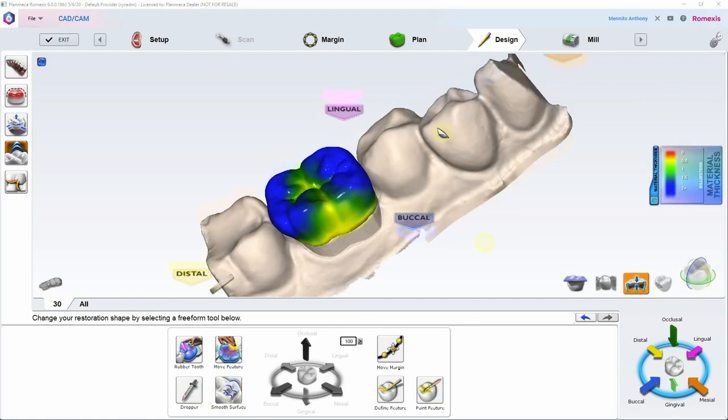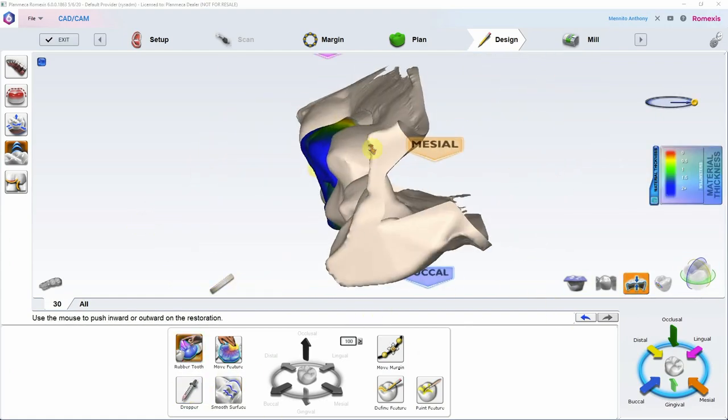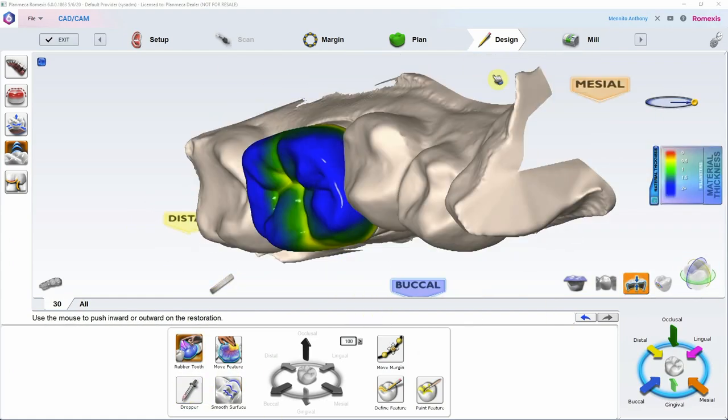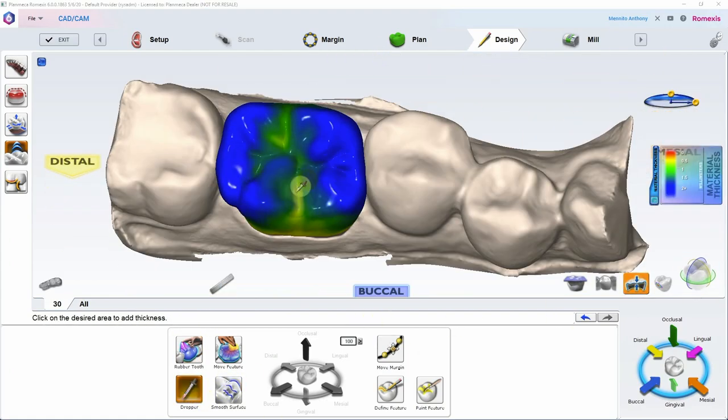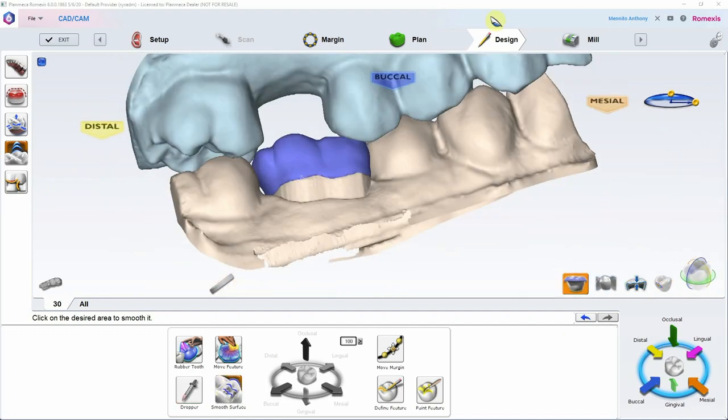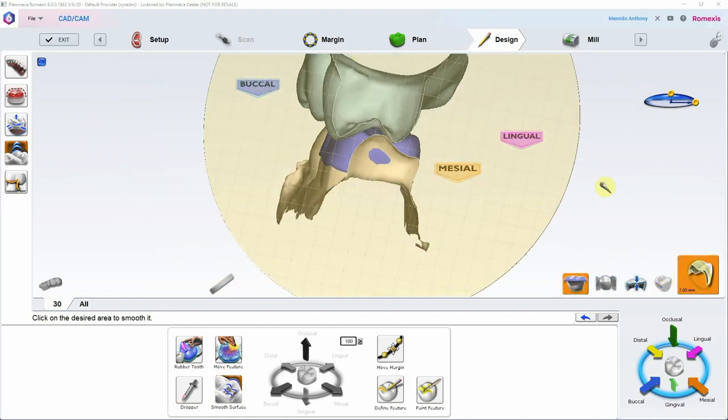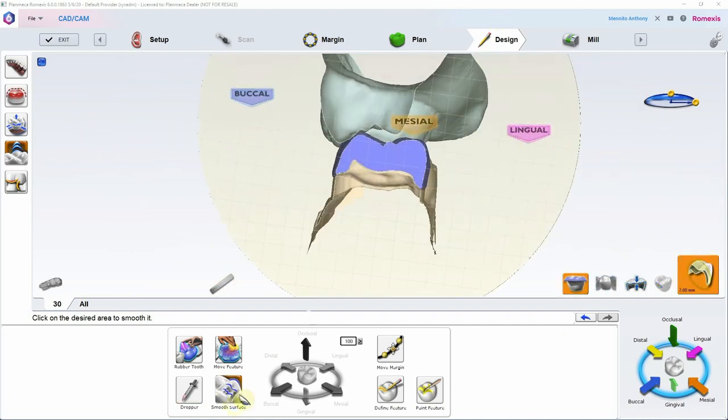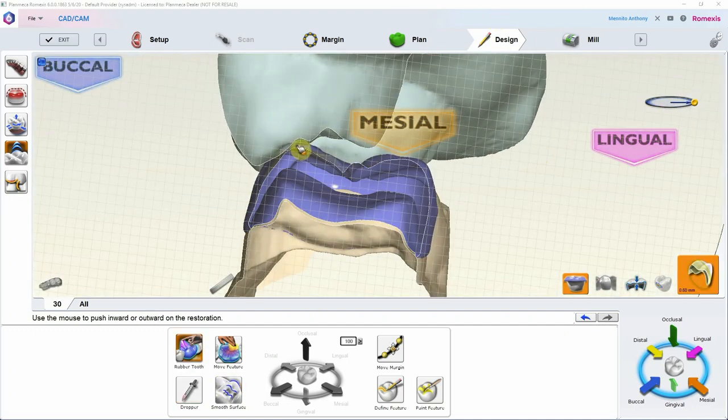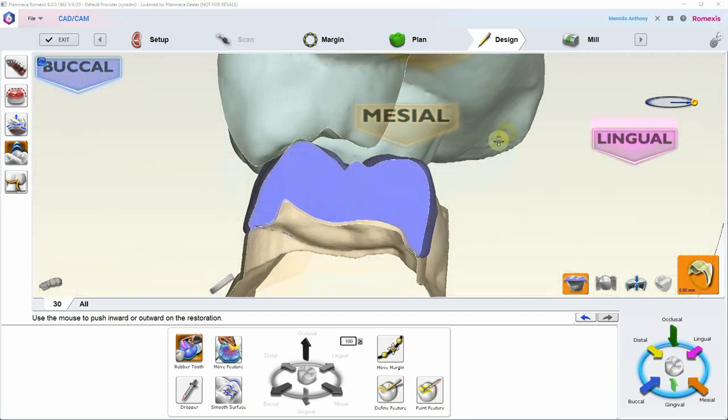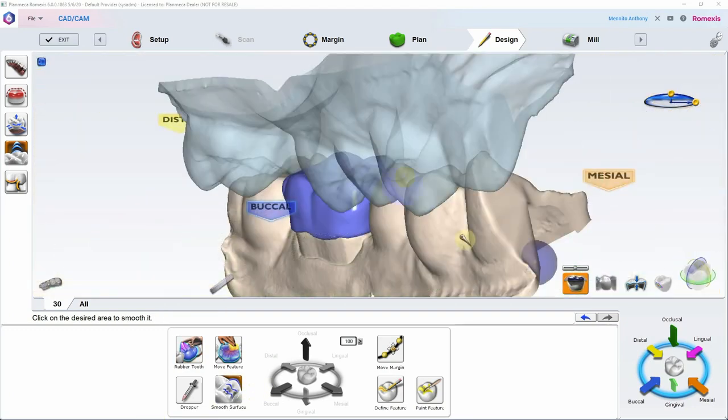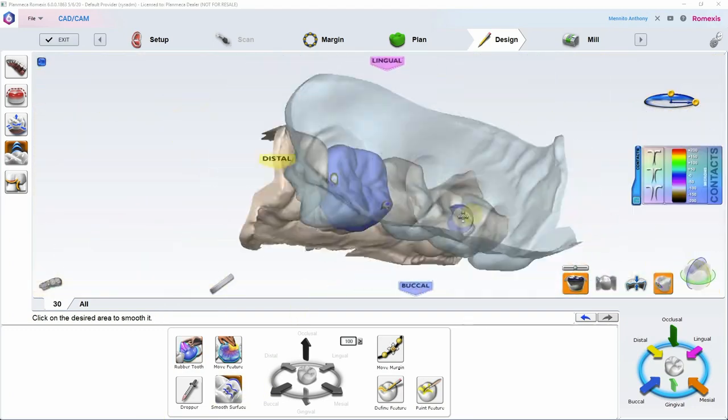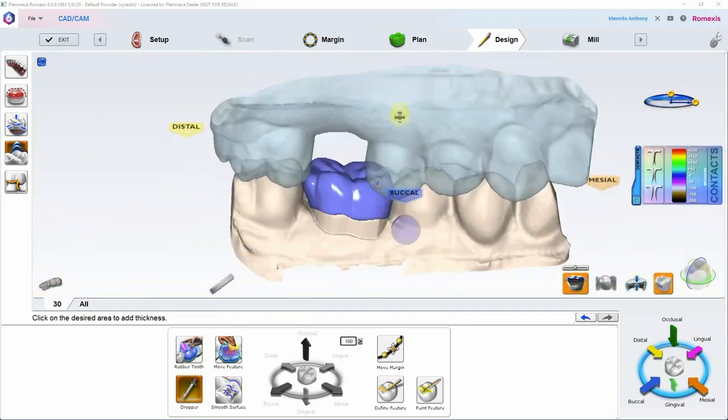The pre-op tool is very, very helpful for that. But since we are just able to import two STLs, the prep and the opposing, we're not able to import a third pre-op scan STL.